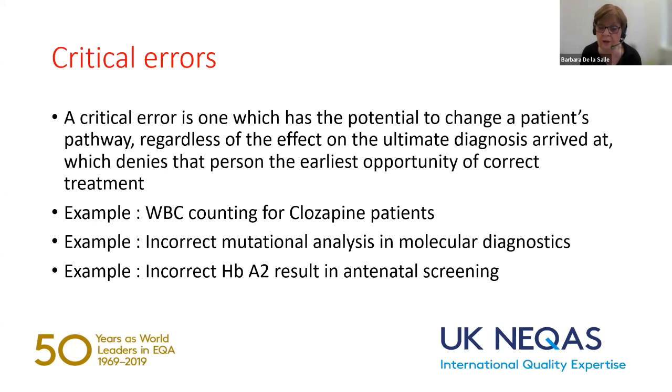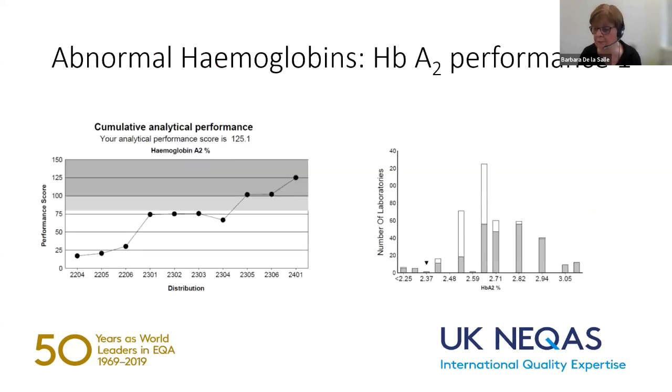All of these things are critical. They'd be critical, absolutely critical, if they're patient samples. The EQA gives you the opportunity of a free lesson in that. And I've got just a couple here of plots from the abnormal hemoglobins program.